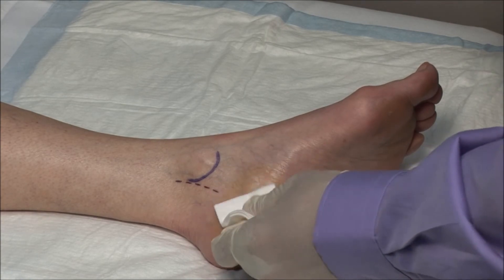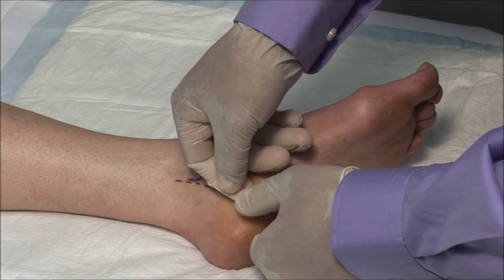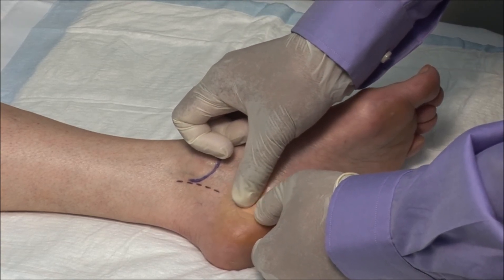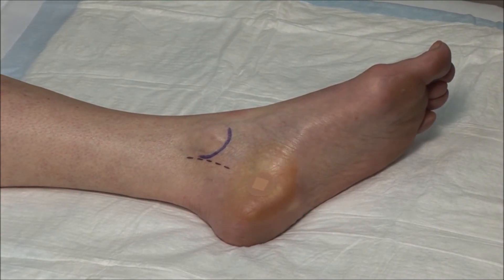Dry the area and apply a bandage. The patient should wait a few minutes before weight bearing and should be advised that pain can be worse for a few hours after the local anesthetic wears off.